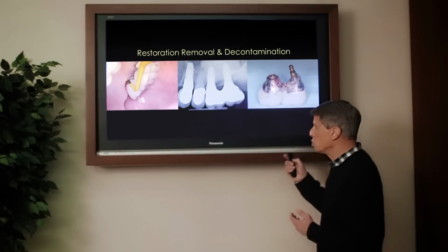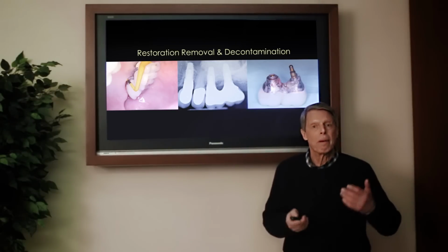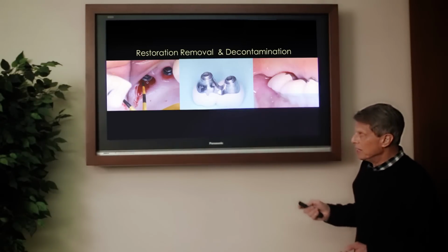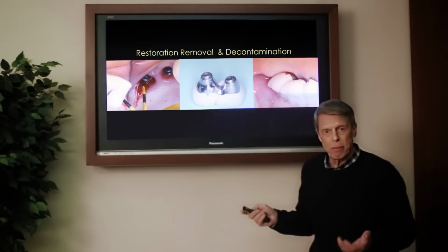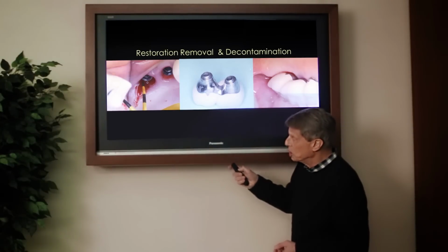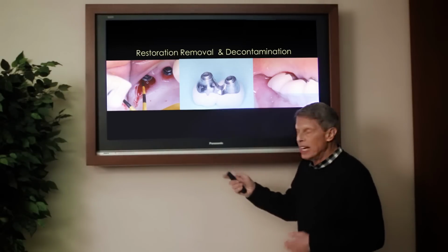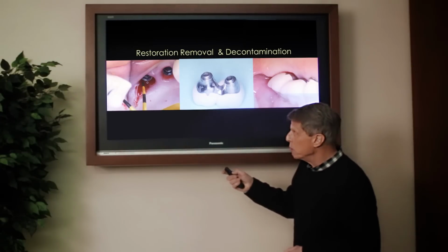If the patient's host resistance gets low, this area would start to break down periodontally because of this plaque sitting right on that soft tissue. What we subsequently did is, and here you can see what the area of mucositis looks like and the inflammation when the restoration is removed, as opposed to this area which is healthier. And what you do here is you curette this area, you irrigate, and you also remove the endotoxin with a cotton pellet from the platform of the implant.